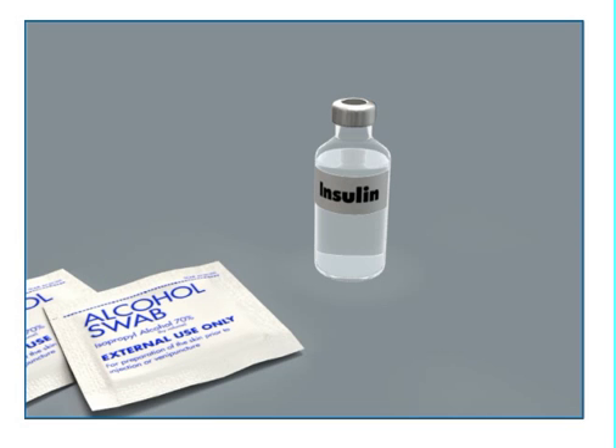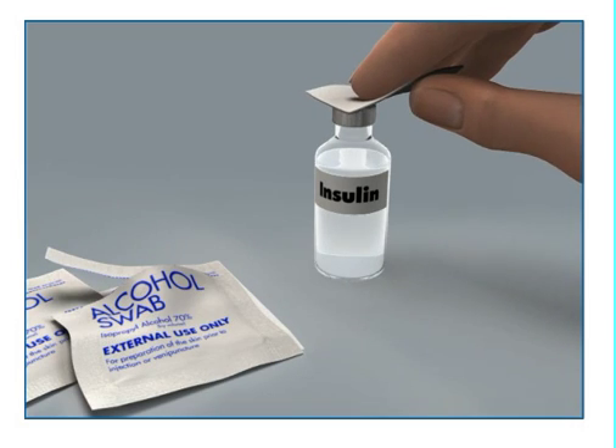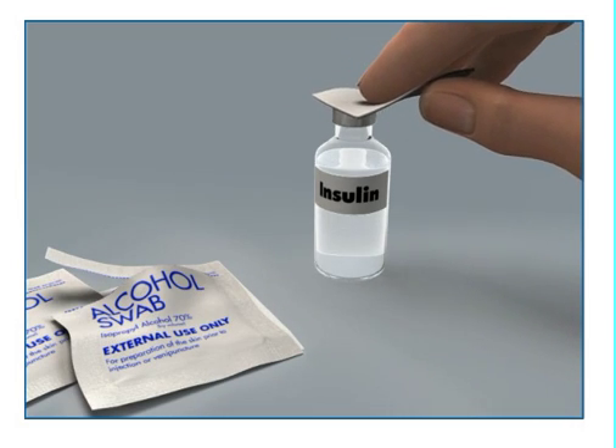To reduce the risk of air bubbles, make sure the insulin vial is at room temperature when you fill the reservoir. Wipe the top of the insulin vial with alcohol and wait until it dries.